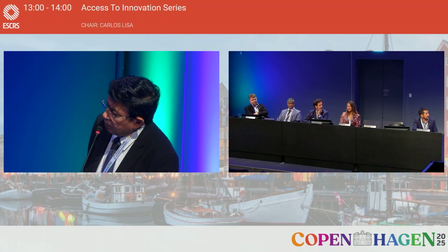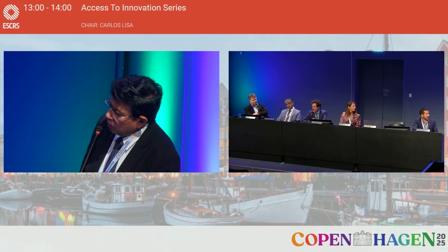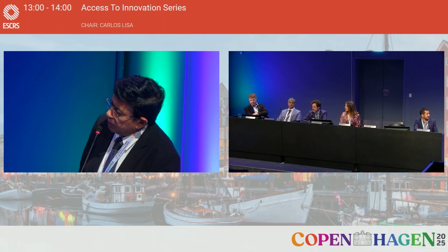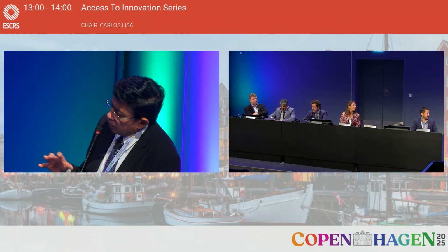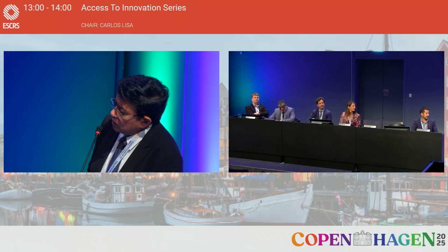This lens has a fair amount of positive spherical aberration. Frankly, though I did ask, because of its proprietary information, I don't have access to what exactly the positive spherical aberration is. And it's a very initial experience. So right now, we have done it on simple virgin eyes without any problem. So the usual contraindications for any multifocals or EDOFs, like a suboptimal optical surface or a macular problem, these are issues, or post-refractive surgery. Obviously, we still have to see whether these lenses will function well.